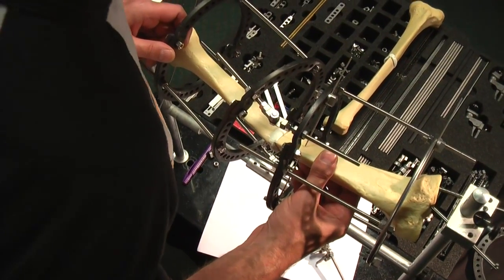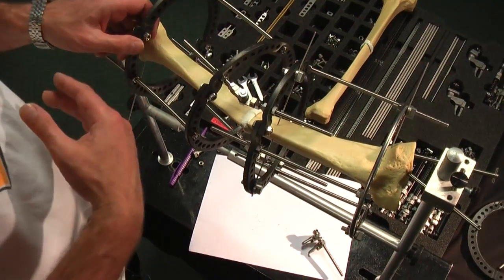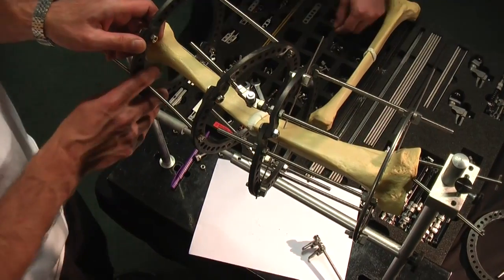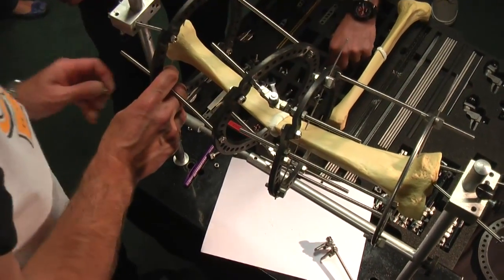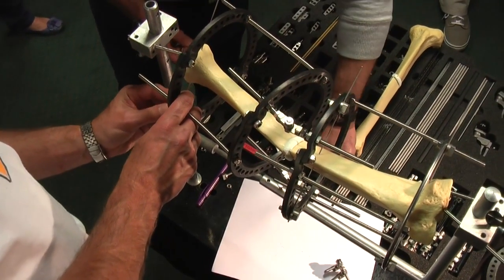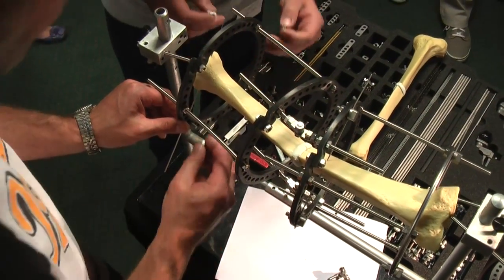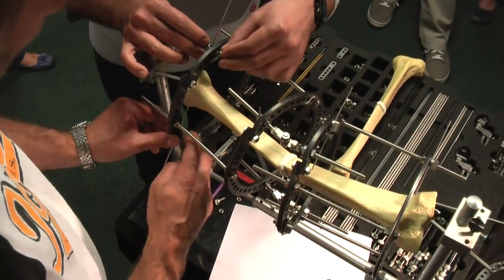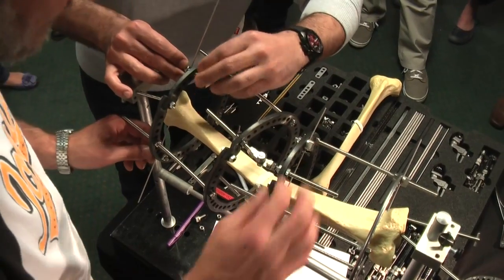And I've got this turned round so I can see 30 degrees, and I can see 30 degrees of deformity in that frame. So all we need to do now is fasten this wire. So the distal reference wire, we're just going to fasten on this distal ring. Snip round and make sure everything's fairly tight.